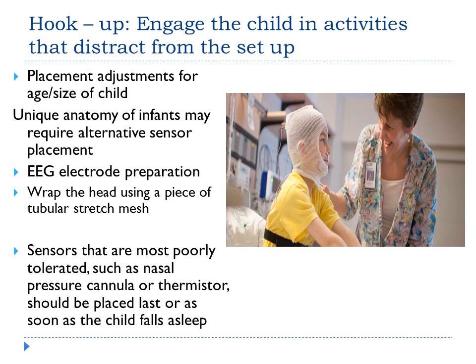Some other factors to consider with your patient's hookup, especially with your infants, is your placement of electrodes may need to be adjusted a little bit. Because of their smaller head size, you may need to use 6-millimeter electrodes. Your distance between your chin EMG leads in small children might need to be reduced from 2 centimeters to 1 centimeter. The EOG electrodes may need to be placed 0.5 centimeters from the outer canthus as opposed to 1.